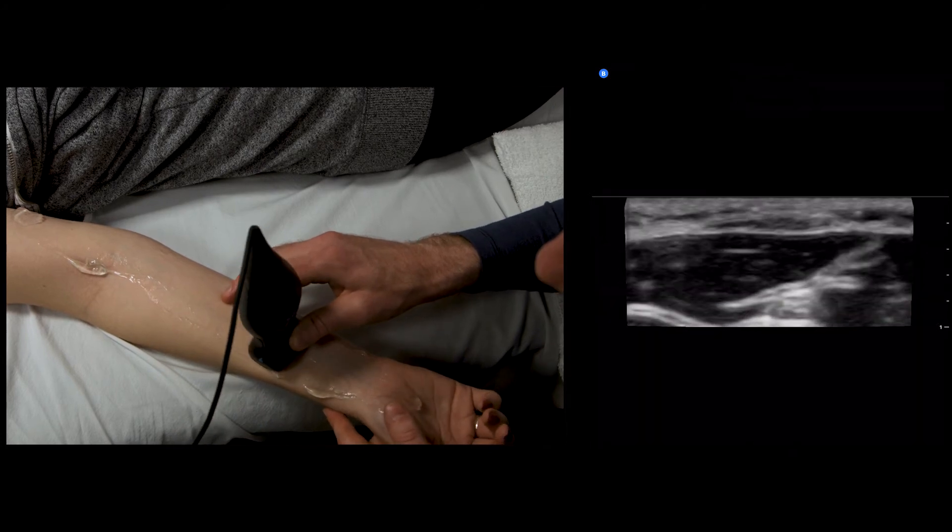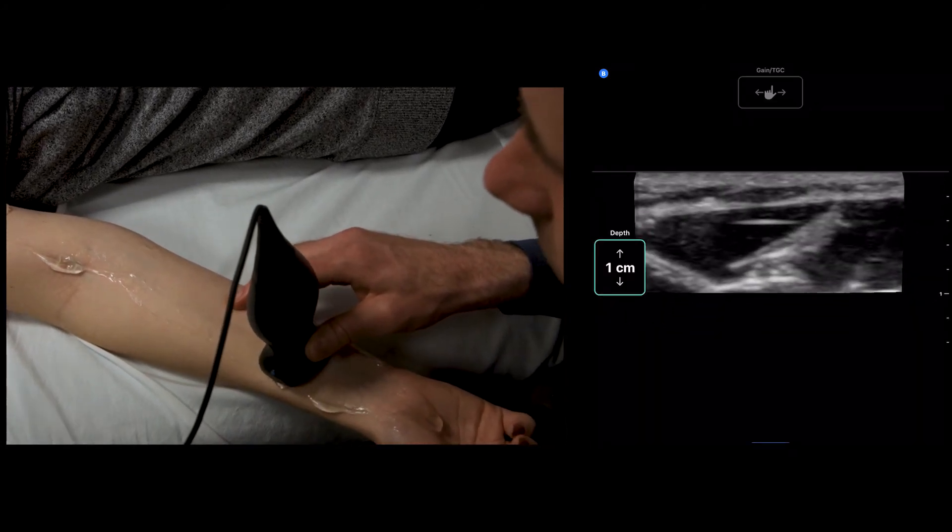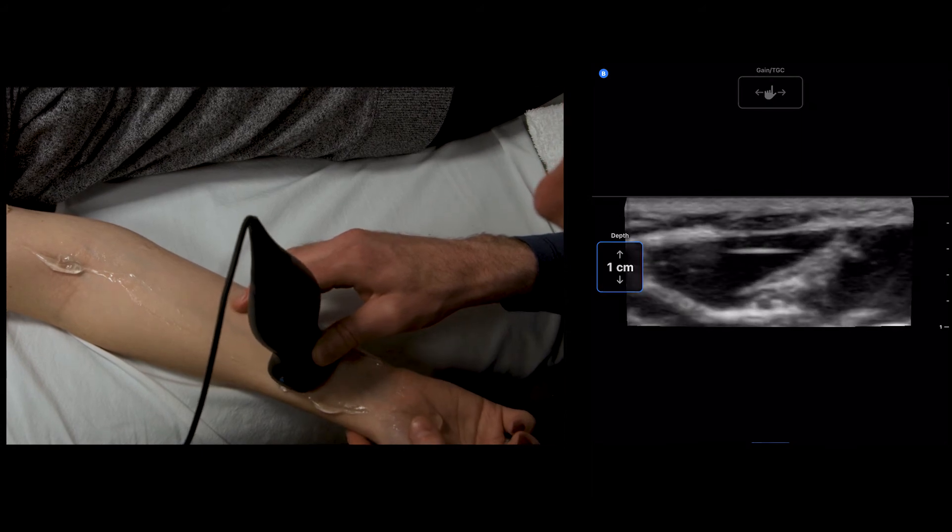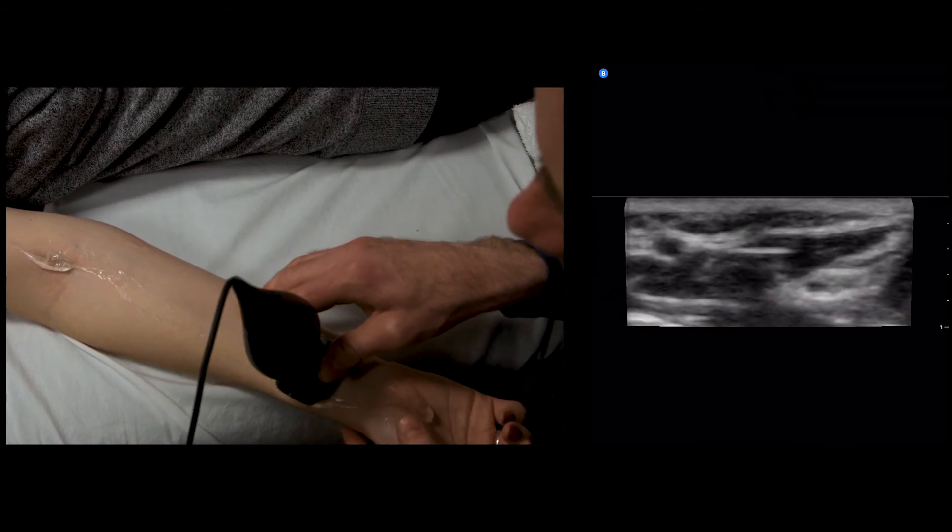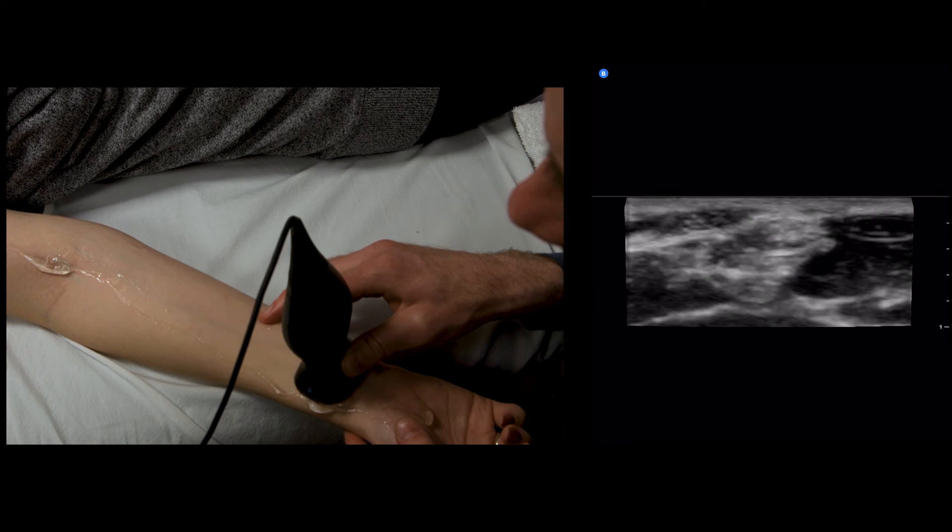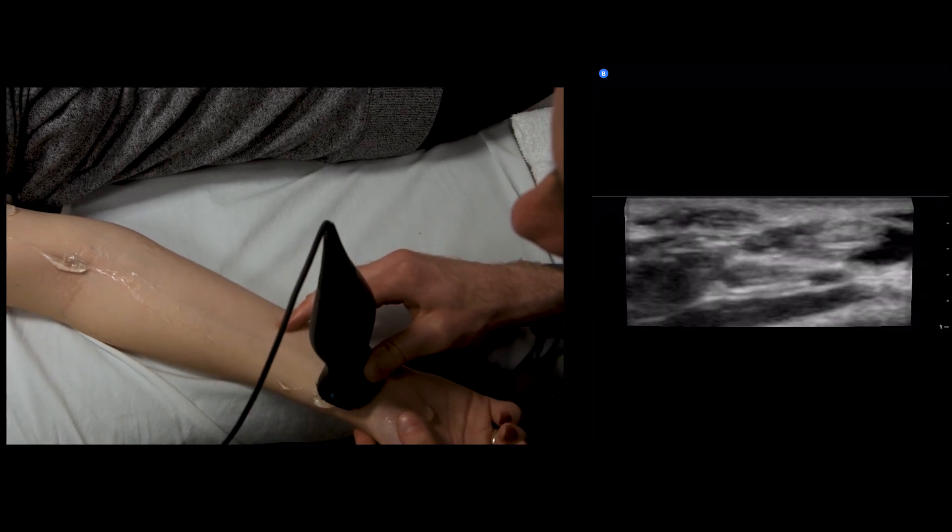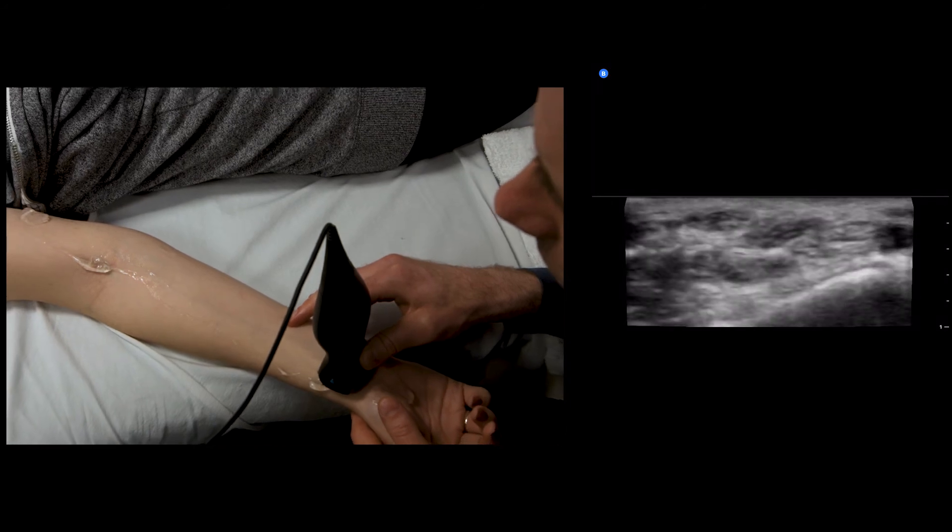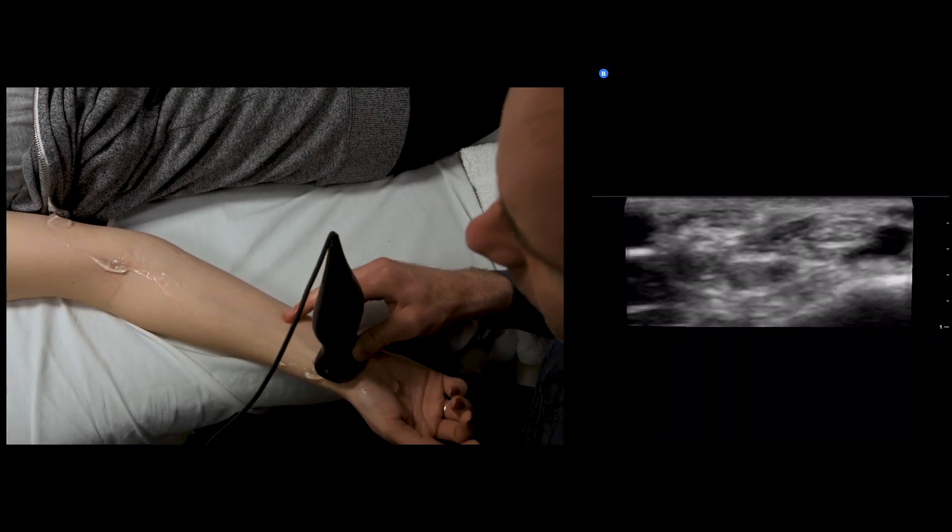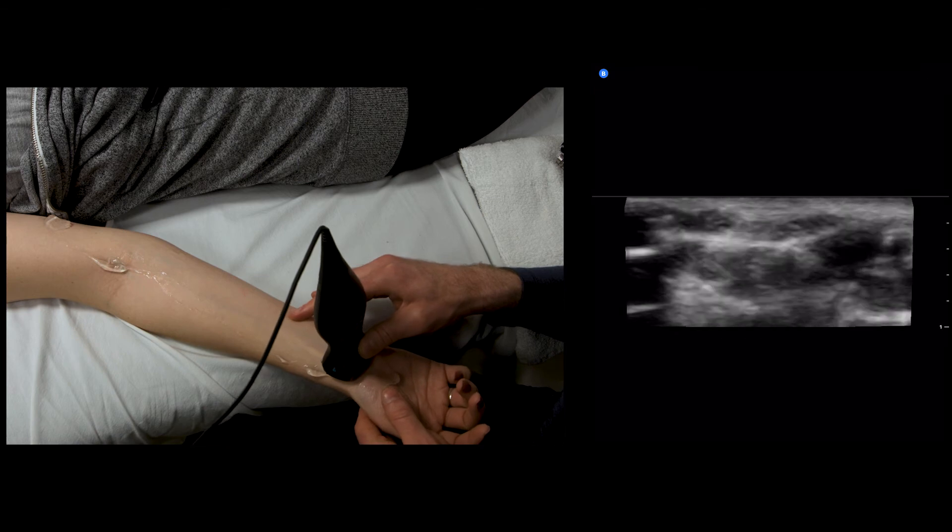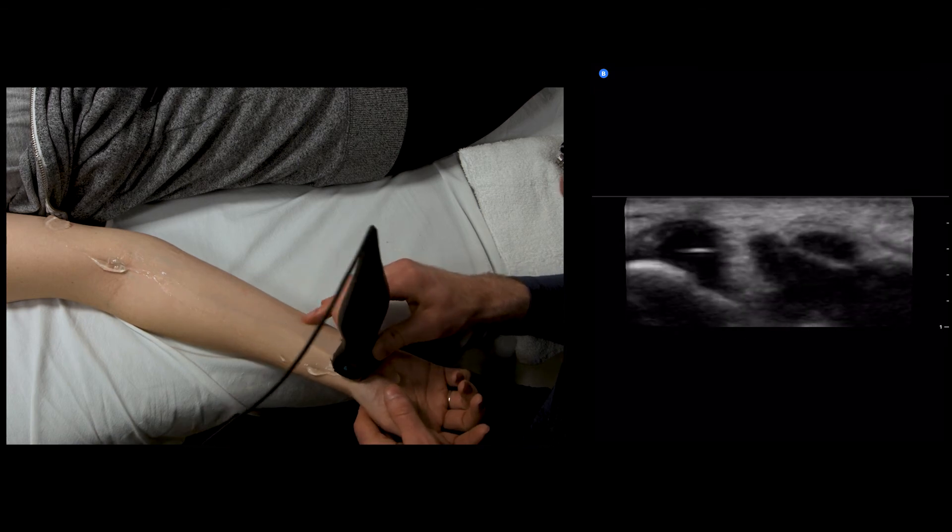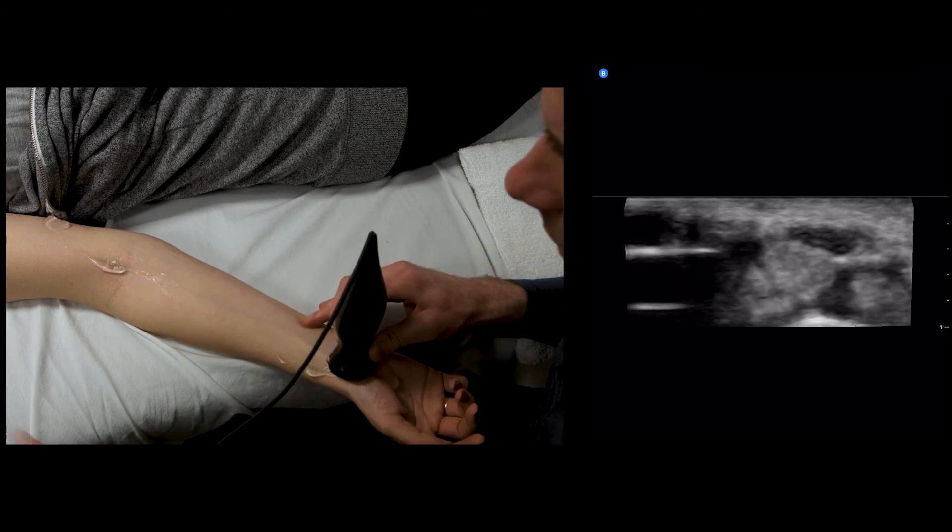I'm going to adjust the screen a little bit. I'm going to follow it. Here it is coming between the FDS and FCR, and then we're going to go into the carpal tunnel here.